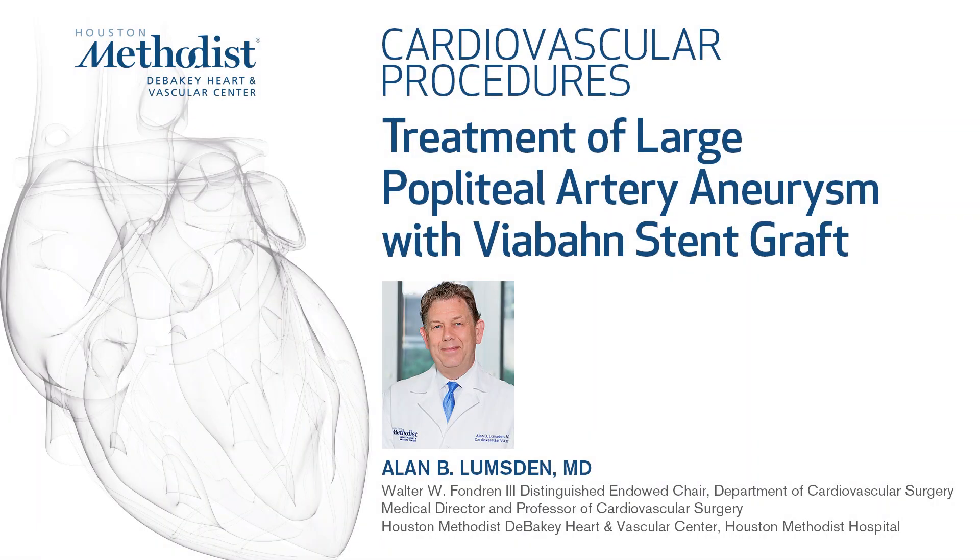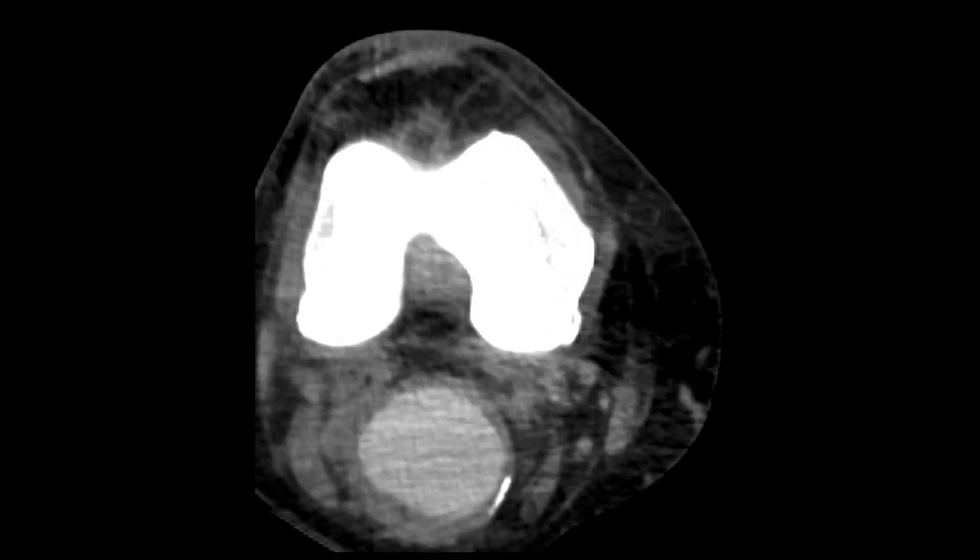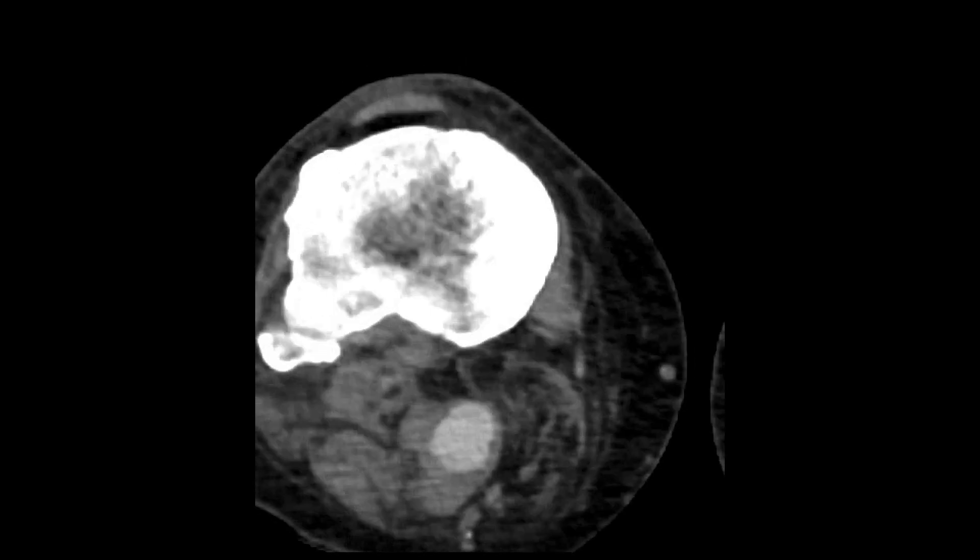In this video we're going to demonstrate the use of viabond self-expanding endoprosthesis to treat a large popliteal artery aneurysm. This patient actually had bilateral popliteal artery aneurysms.